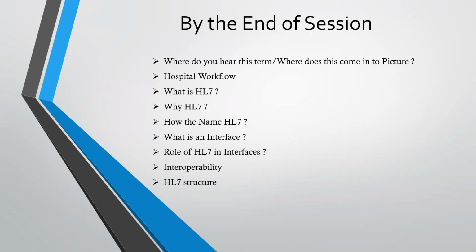So by the end of today's session, we'll see what is hospital workflow, what is HL7, where do we hear this term HL7, why we need HL7, and how did we conclude, meaning how did the industry conclude, on this name? We'll also talk about interfaces, and what is the role of HL7 in healthcare interfaces. We'll also talk about interoperability and HL7 message structure.